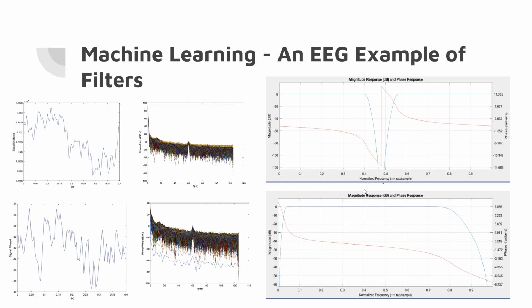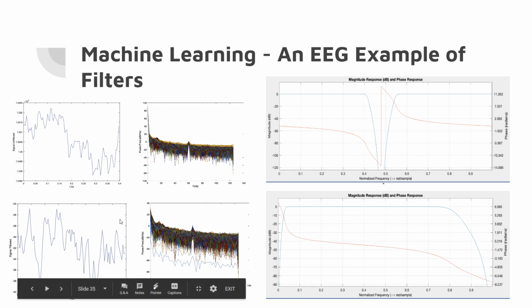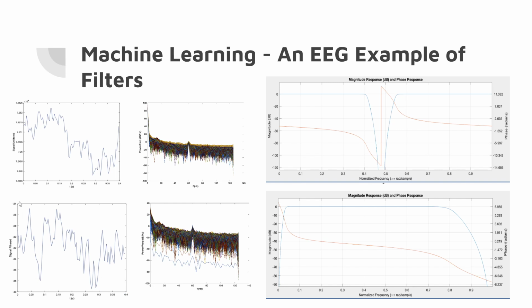And to go back to the signal itself, this is an example recording of a blink artifact, and you can see how large in magnitude it is comparatively up here. Make sure you look at this 10 to the 4th, it's kind of important. And you look down here, and that's gone.